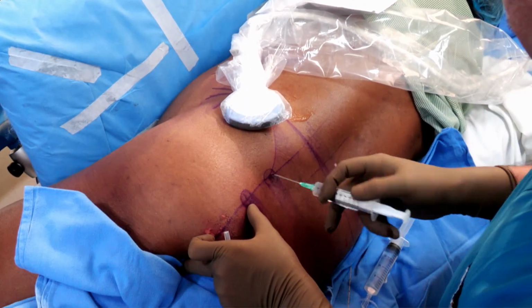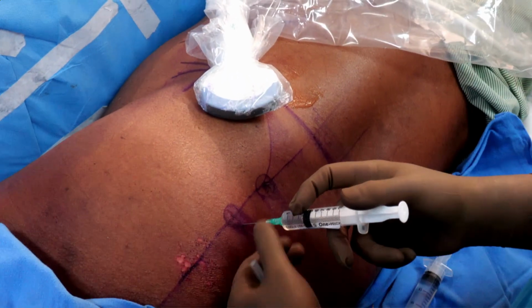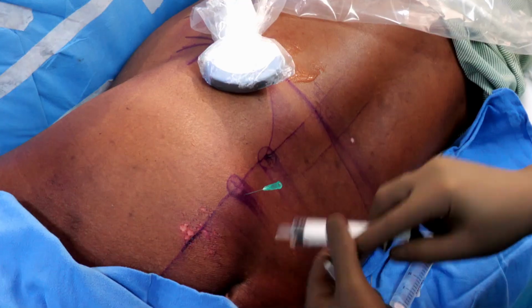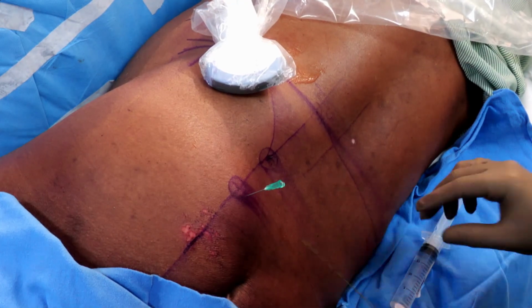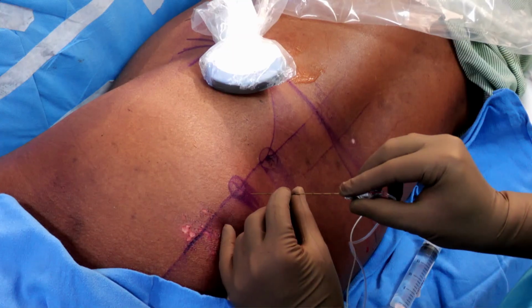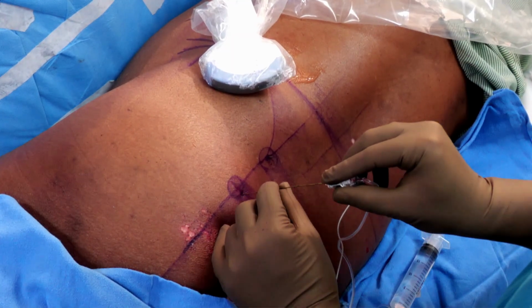So somewhere along this point would be the needle insertion. I'm just giving a local here, and we progress with the needle placement. Again, can somebody please increase the current a bit, to around 1 milliampere.